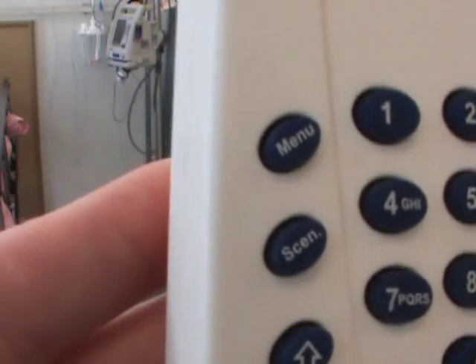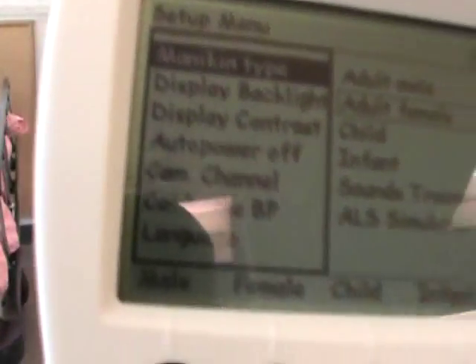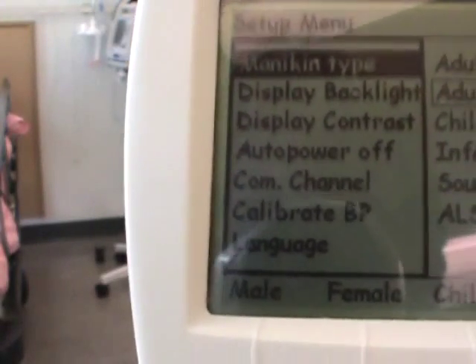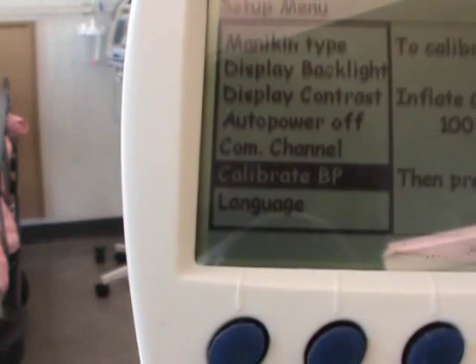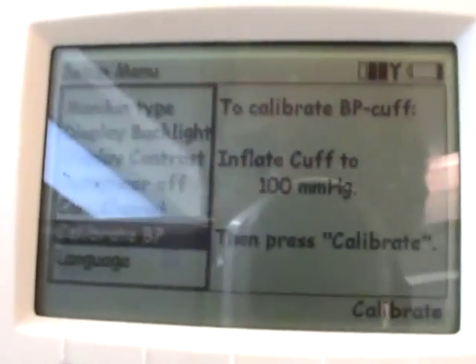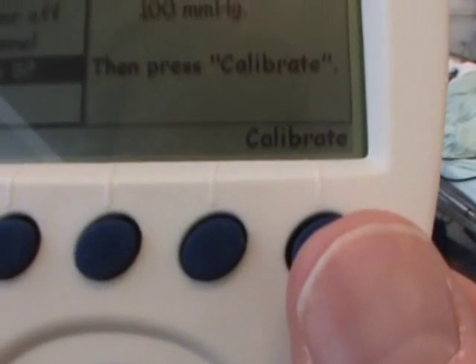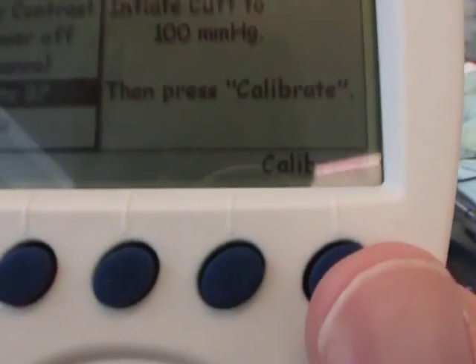Go to your menu button. Press menu, and then on the screen, use the down arrows to scroll down to where it says calibrate BP. You just leave it there. You can see that on the right-hand side of the screen, it says to calibrate BP cuff, inflate cuff to 100 millimeters of mercury, then press calibrate. The calibrate button is in the bottom right-hand corner. We're not going to press that yet because we haven't inflated the BP cuff yet. Let's go do that.